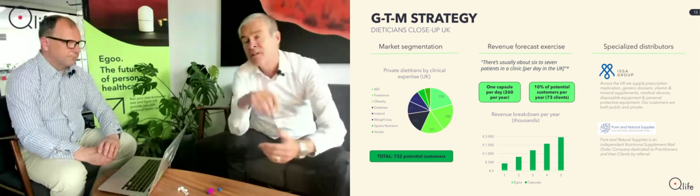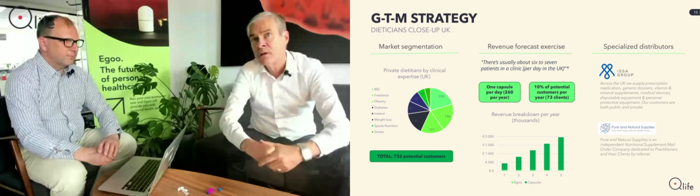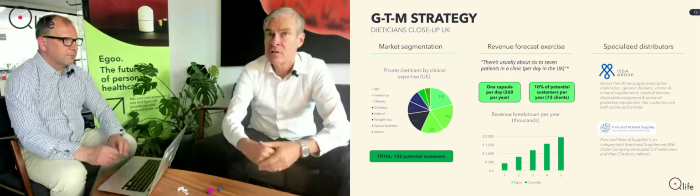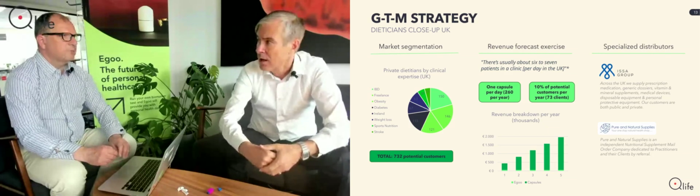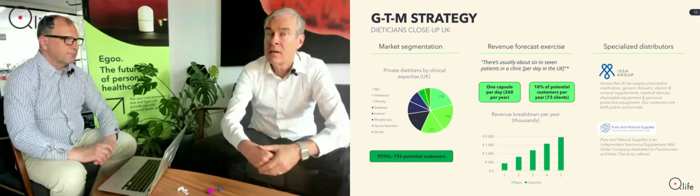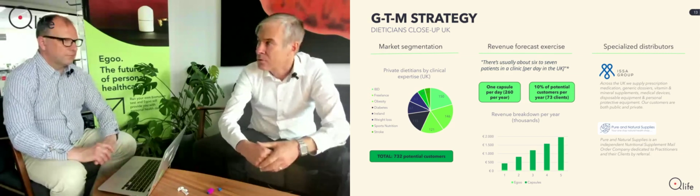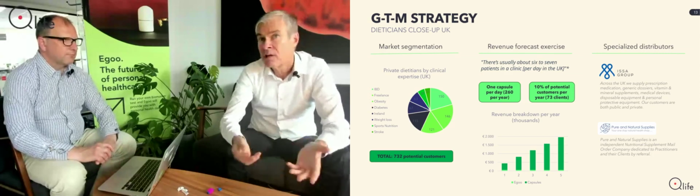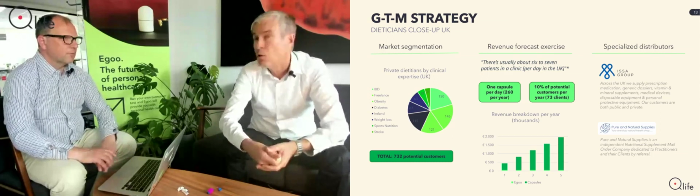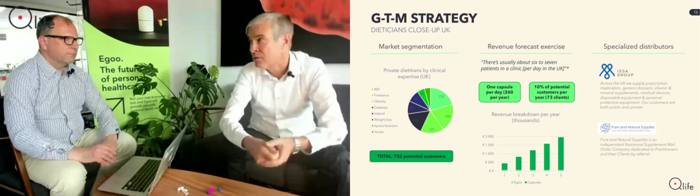I can also mention, going to one of the questions, that we are in the UK, for instance, in the process of entering partnerships with distributors that are obviously targeting these clinics. So we are focused on basically rolling out the product and having efficient distribution in local markets. So that's what we are very focused on right now.